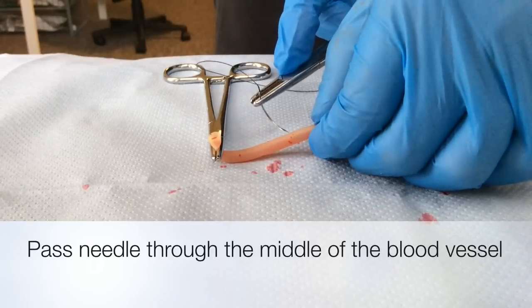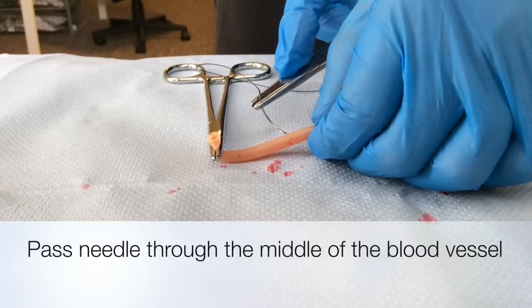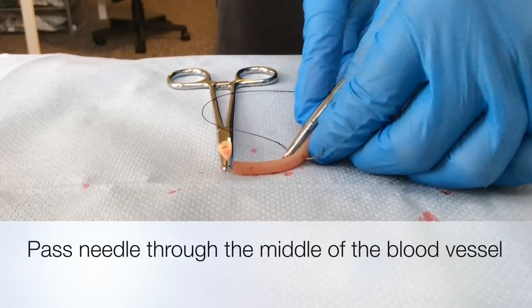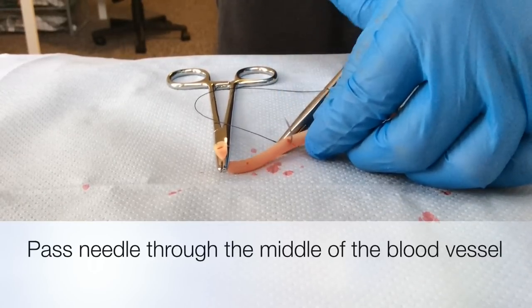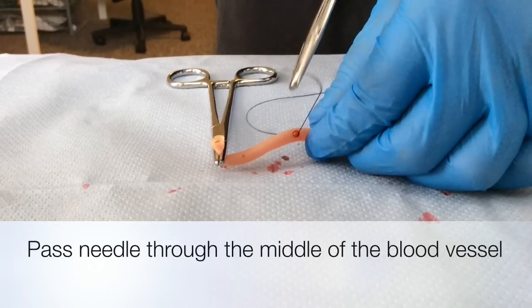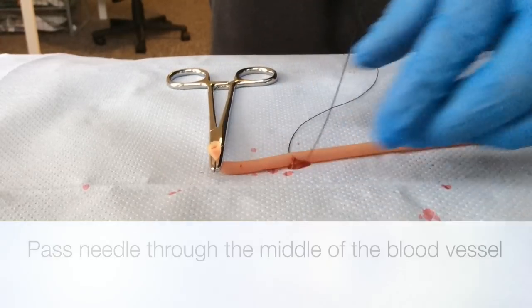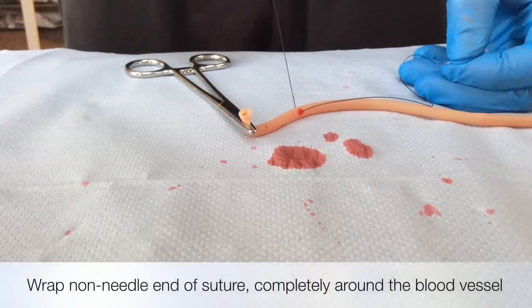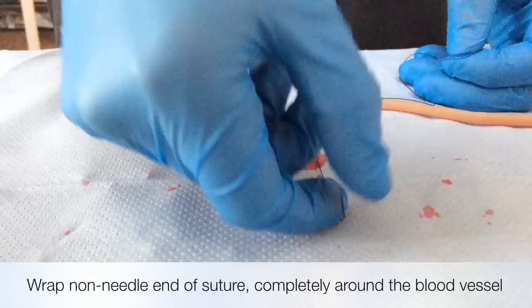Acquire some suturing material with a curved needle and pass this through the middle of the blood vessel. Then grasp the non-needle end of the suture thread and wrap it once completely around the blood vessel.